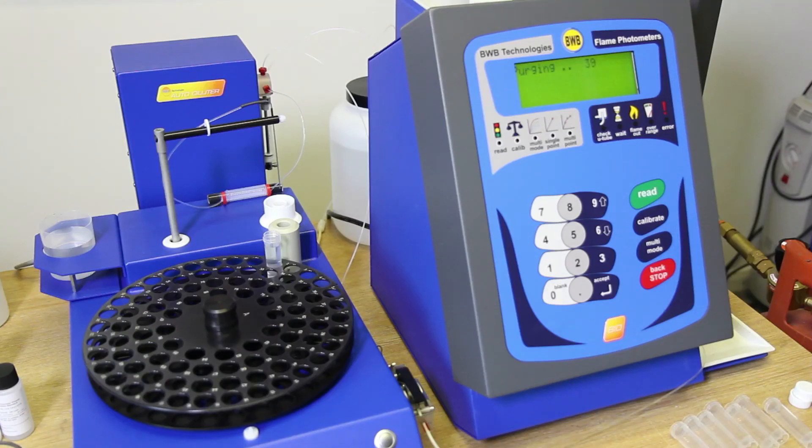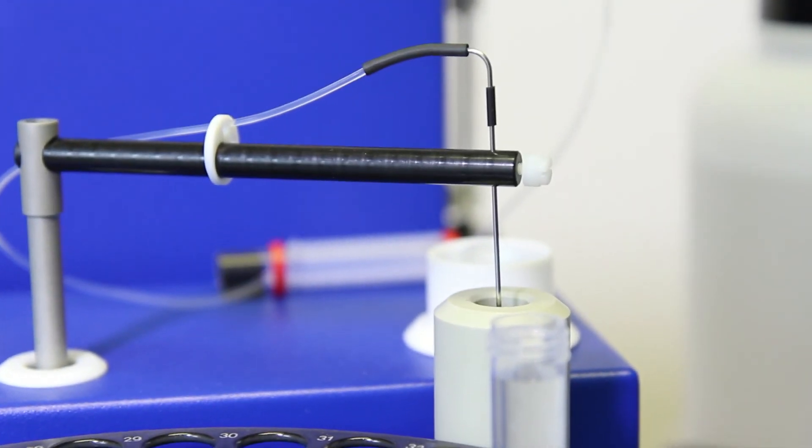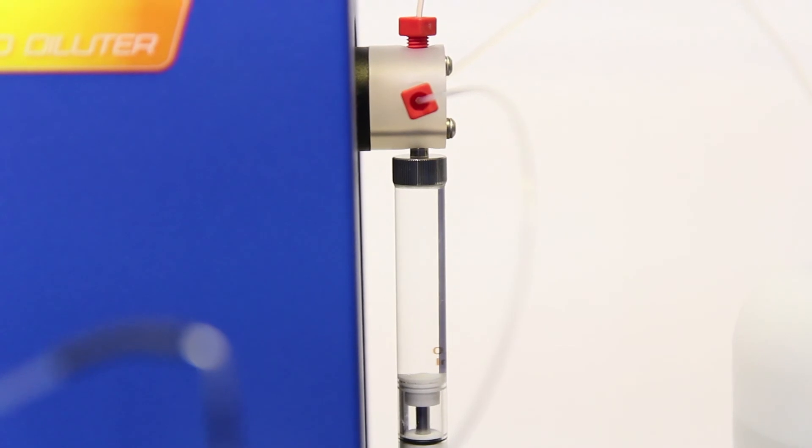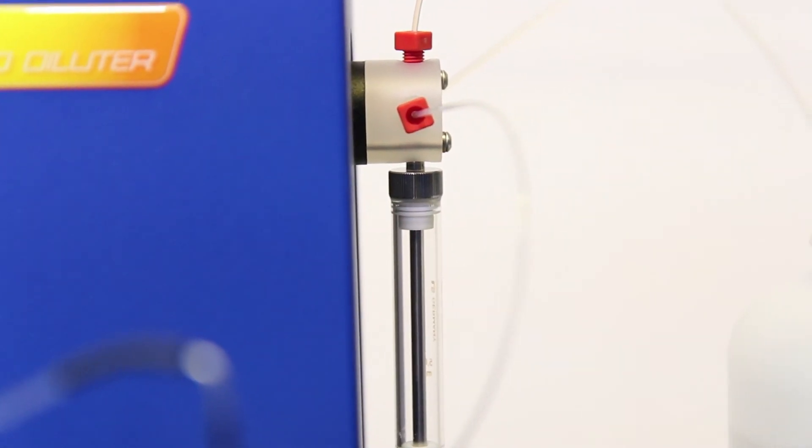The AFHS will then proceed to take a reading and recalibrate the curve. The process only takes a couple of minutes and helps to ensure that your BWB Bio is running at peak accuracy.